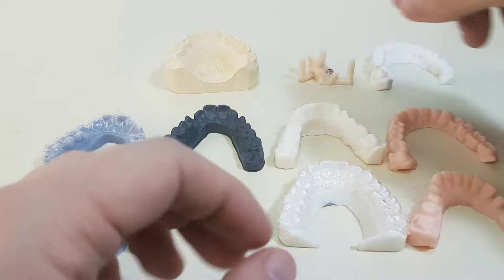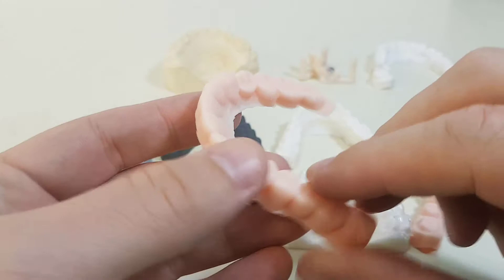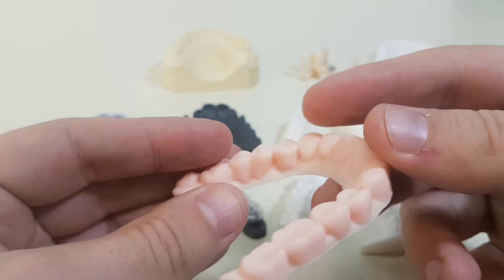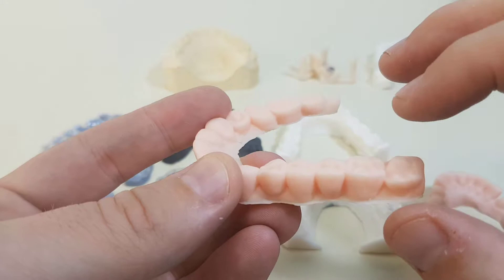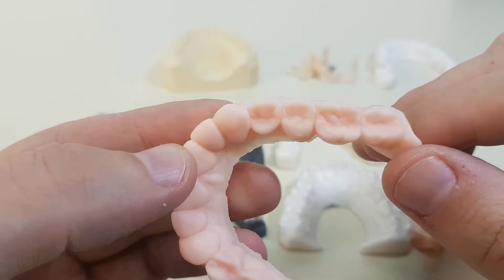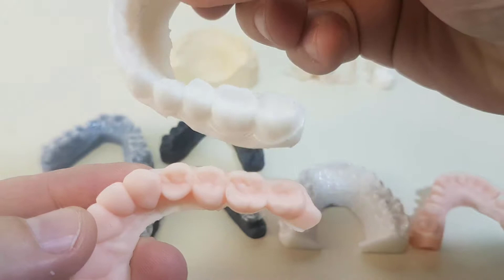With the same printer but a different material, this is the color resin. I painted it the peach color — it was for another project — but it comes out perfect. It is kind of similar to the Formlabs model resin, which will be a little brownish maybe. But you can immediately see that it was much easier to identify the small details that on the white resin might go unnoticed.